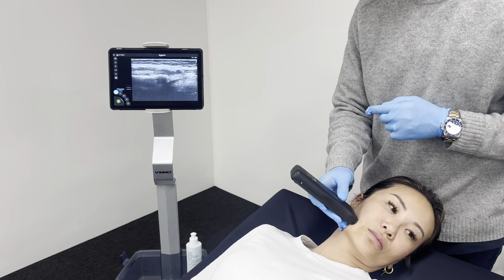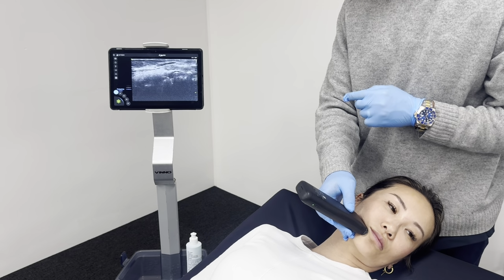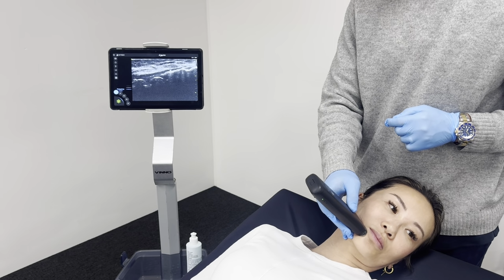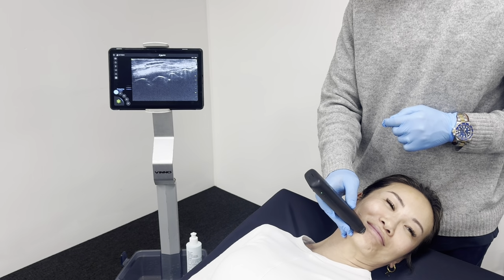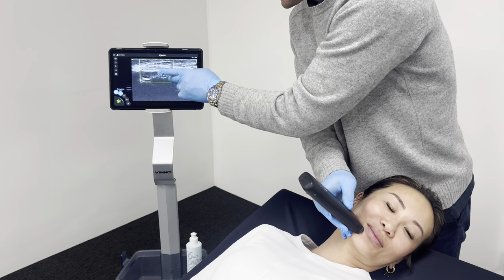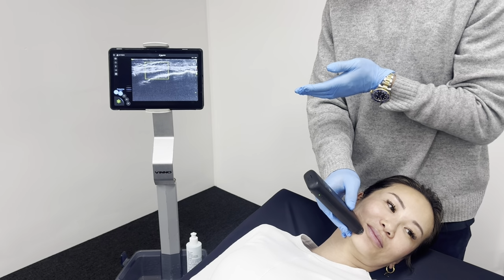So let's move on. Let's go down to the DAO again. So we've got the DAO down here. Now underneath the DAO, we also have the DLI. So could you make a bit of a sad face? So you can see a little bit of that DAO moving a little bit. And then we're going to put the colour flow on and bring the colour flow box up. So you can just adjust the size of the colour flow box by using your fingers on the screen.